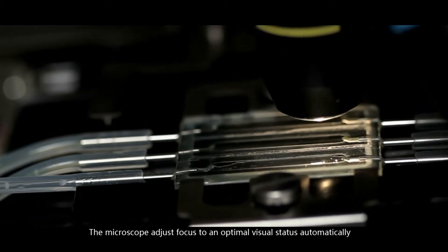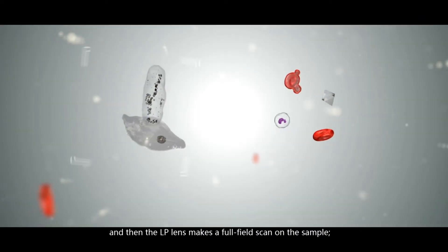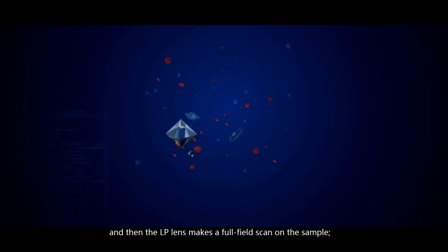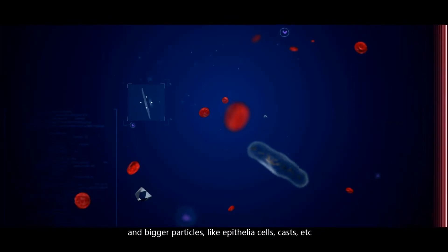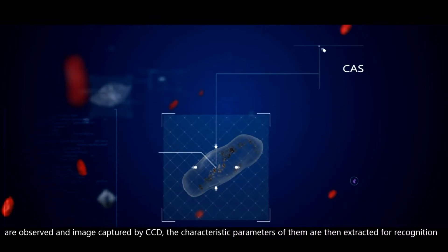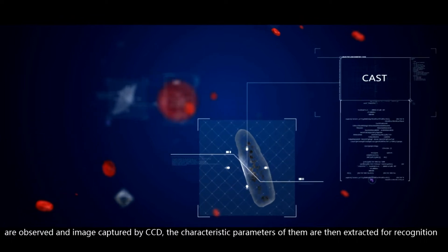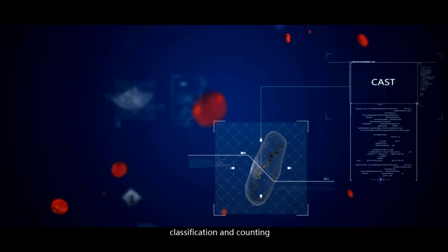The microscope adjusts focus to an optimal visual status automatically, and then the LP lens makes a full field scan on the sample, and bigger particles like epithelial cells, casts, etc., are observed and image captured by CCD. The characteristic parameters of them are then extracted for recognition, classification, and counting.